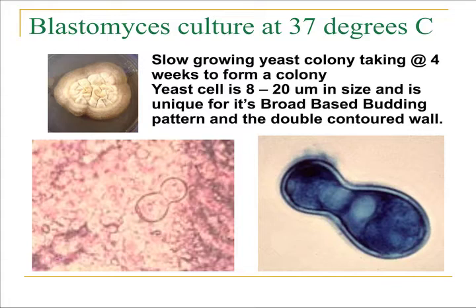It is a slow-growing yeast colony and can take up to 4 weeks to form a colony on an agar plate. The yeast cells are large. They're 8 to 20 microns in size, and it is unique in that it produces a very broad-based bud. And so that's one way you can remember this organism. Remember that Blastomyces is a broad-based budding yeast. I think that is shown well in the pictures in the bottom of this slide, where you can see a double contoured wall and very easily see that it is a broad-based bud between the mother and daughter cell.